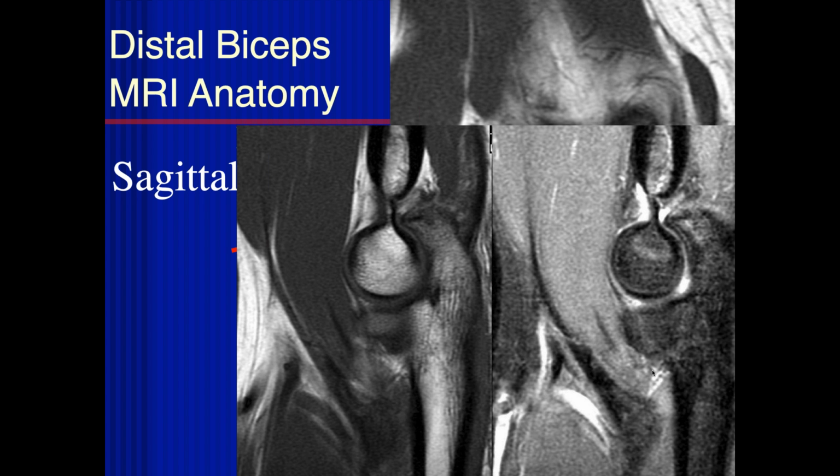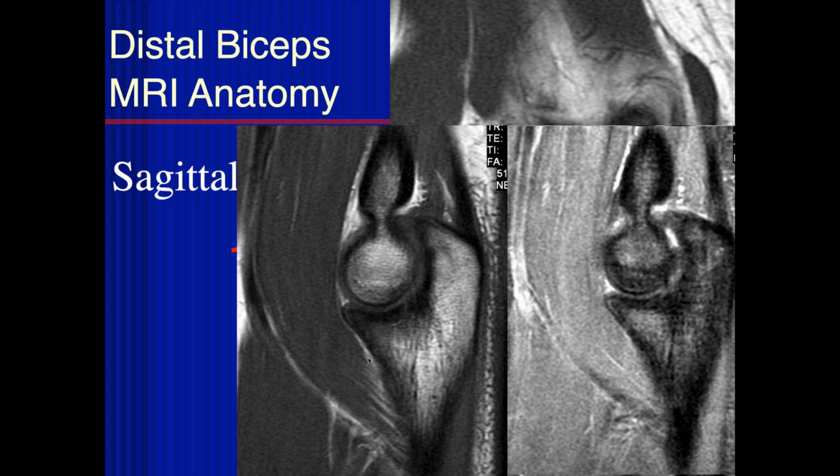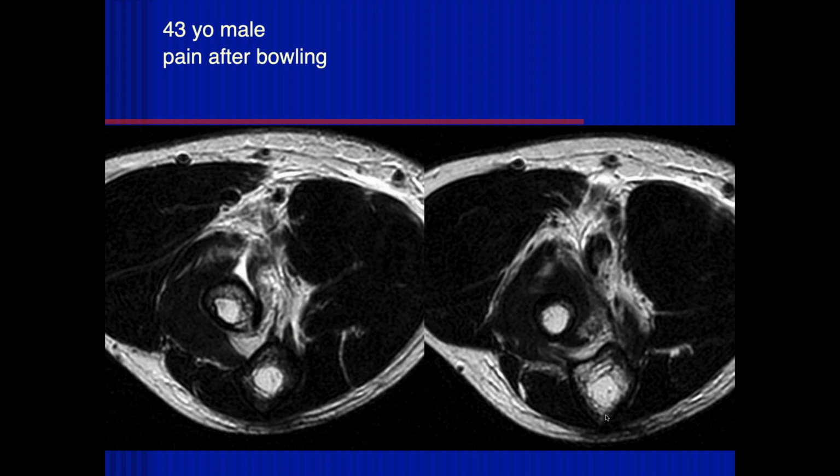Now, the thing about the brachialis is that very commonly the distal aspect of the muscle will attach to the ulna, and you may not have a tendon, or you may have a combination of muscle and tendon. But usually you'll have at least some muscle going all the way to the bone, as opposed to a lot of other muscles and tendons where the muscle stops short of the bone. Here you can see the muscle fibers coming all the way down to the ulna, which is common for the brachialis distally, which means its signal is a little bit different than most tendon-bone interfaces.